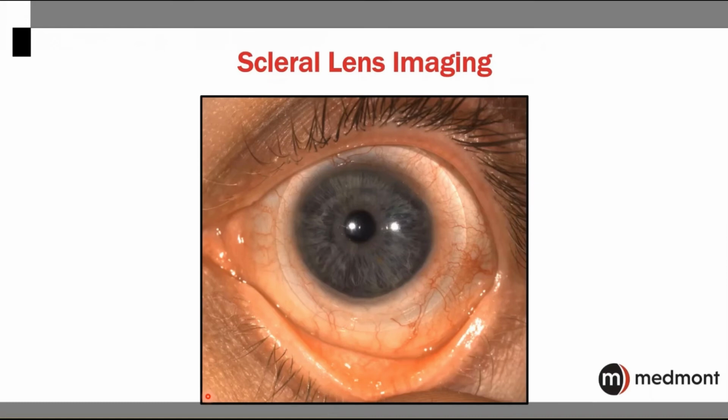And for all of you that are at the GSLS because you love the fitting of specialty contact lenses, the white light assessment and that large field of view becomes very beneficial when we're imaging some of our toughest contact lens fits, and being able to share this information with the lab to get some assistance to optimize the fit of this lens.